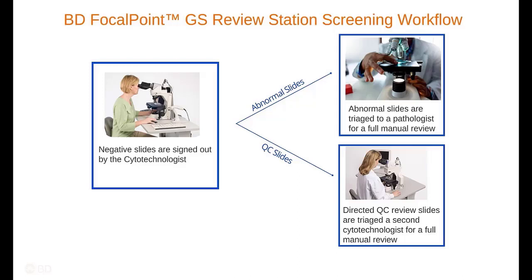Once the analysis is complete and diagnosis is determined, the slide can be signed out if it does not contain an abnormality or does not need a quality control review. If the slide does contain an abnormality or there are any features of diagnostic significance, it will then be triaged to a pathologist for final analysis and sign out.